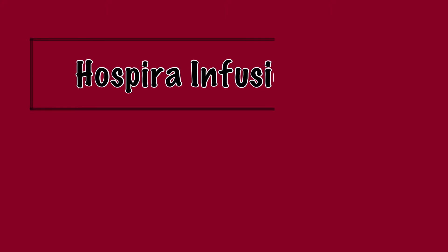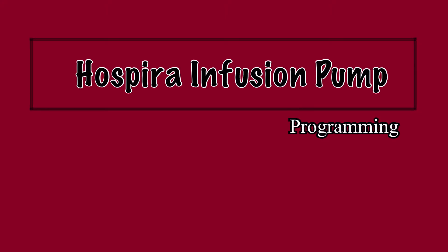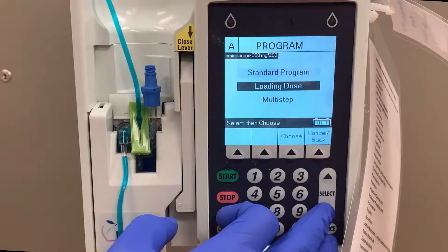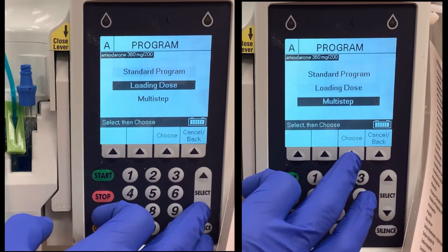In this video about the Hospira Plum A-plus infusion pump, we will explore some more intricate methods of programming a medication infusion. Along with standard programming, the Hospira pump has options for loading dose and multi-step programs. These are useful when the rate of an infusion will change after a pre-decided amount of time.